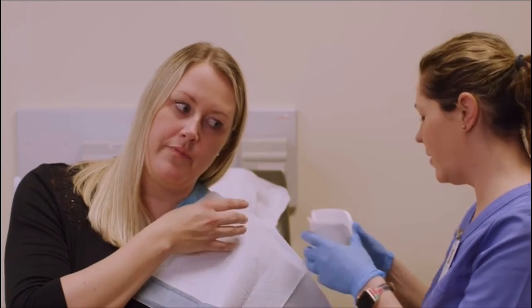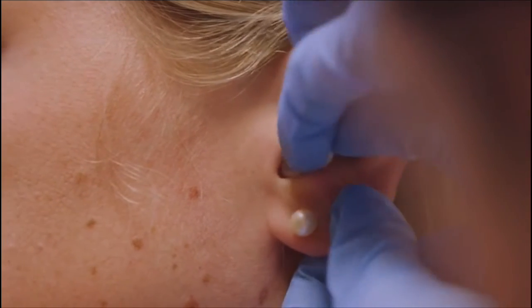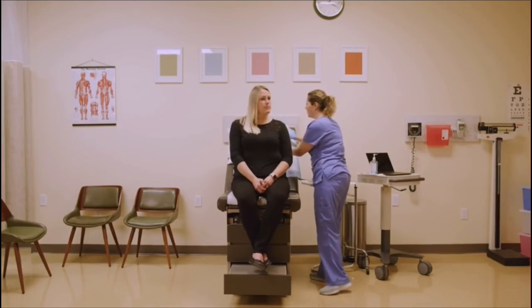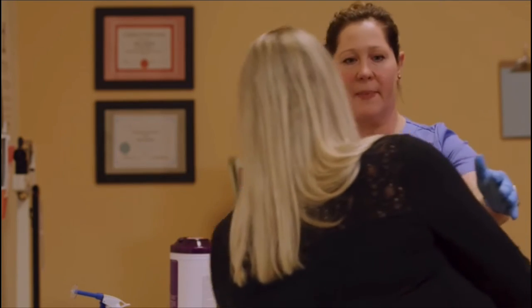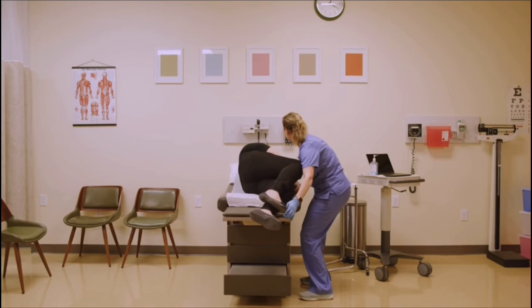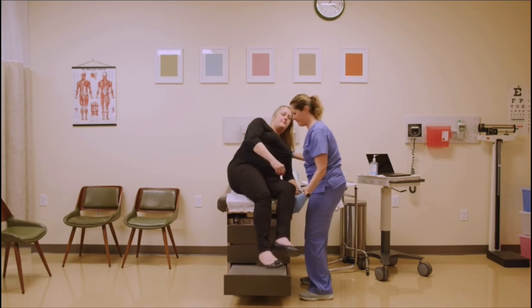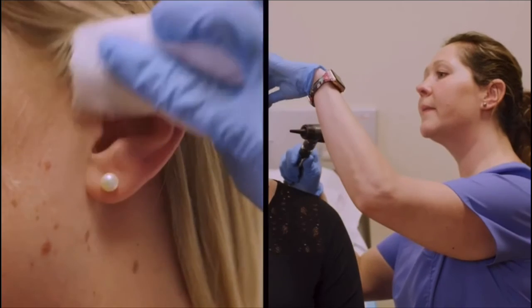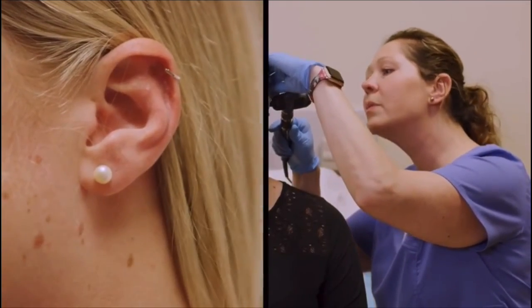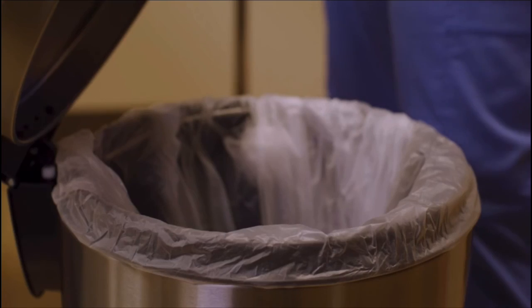Remove basin from the patient and insert a cotton ball loosely. Place a waterproof drape on the exam table and have the patient lie on their affected side for 15 minutes. Dry the outside of their ear with gauze and inspect it using an otoscope with a disposable speculum. The provider will recheck the patient's ear and determine if any additional treatment or follow-up is necessary.